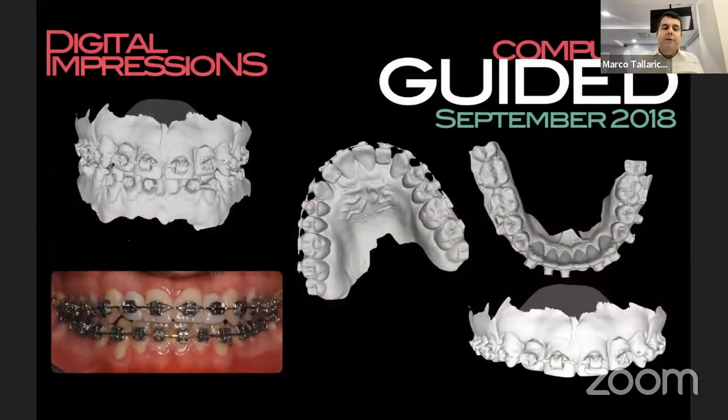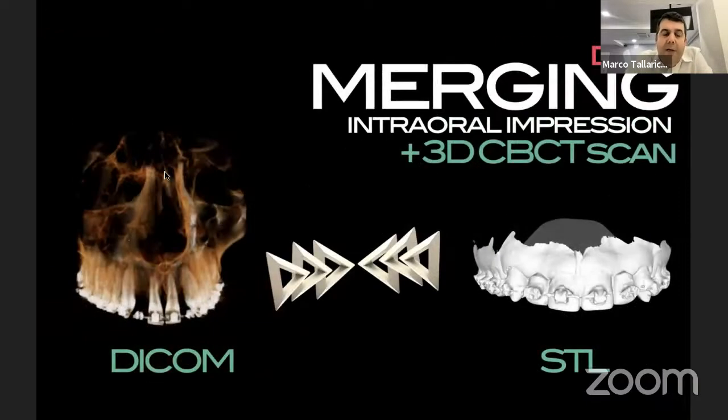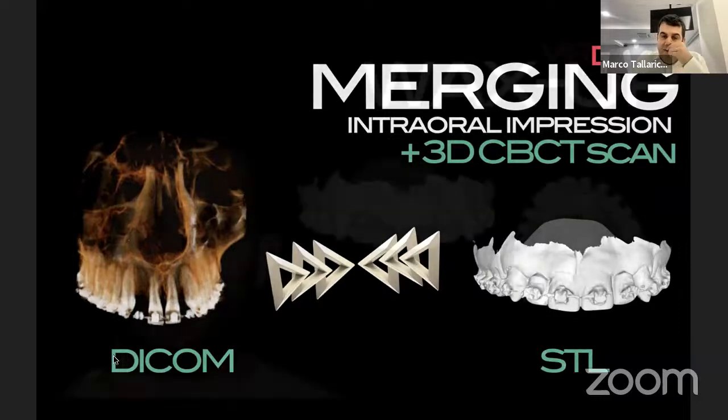And finally, when the orthodontic treatment was almost finished, we can start with impression. Intraoral scanner is also very nice for interdisciplinary treatments. For example, patient with the brackets, we can take the impression without any kind of problems for the material inside the brackets. Look at the impression, CBCT scan, as I told you before, the patient must have the mouth opened, intraoral scanner, CBCT scan, and we merge in a software.